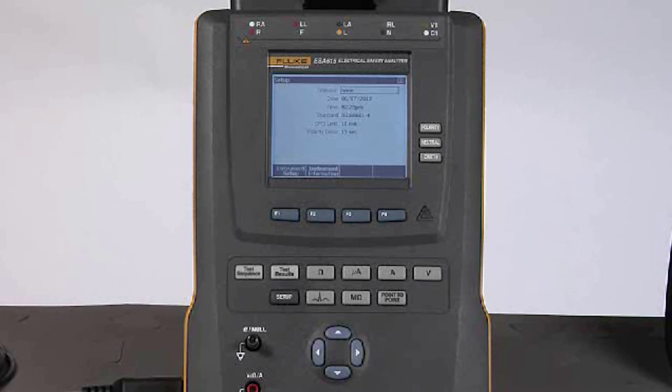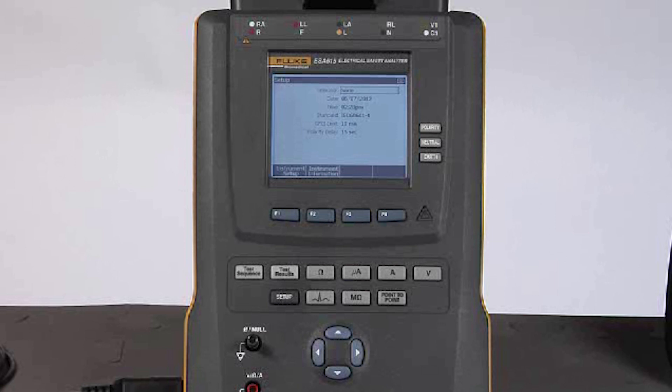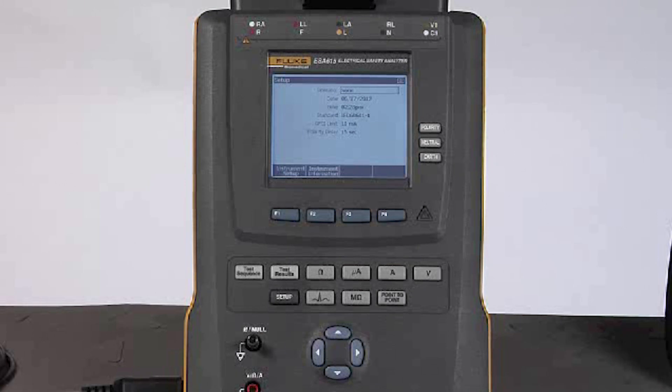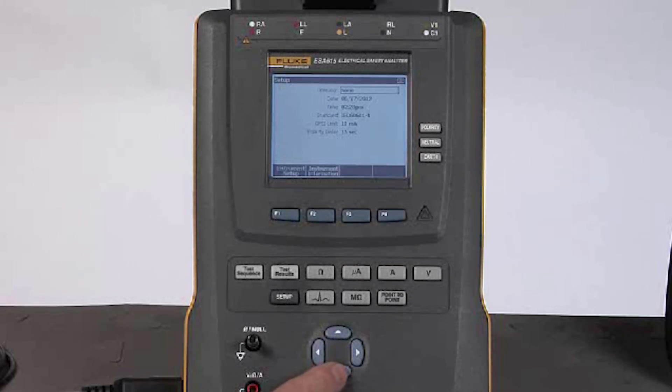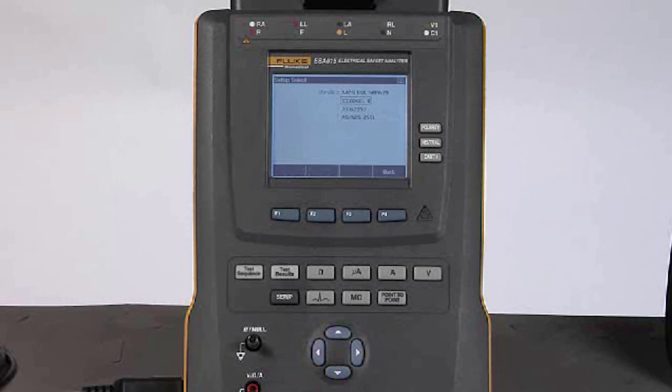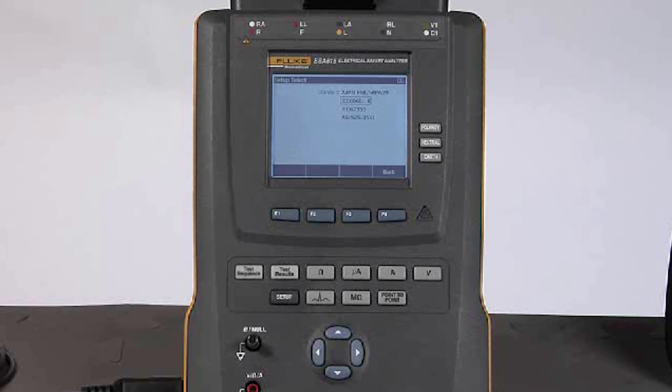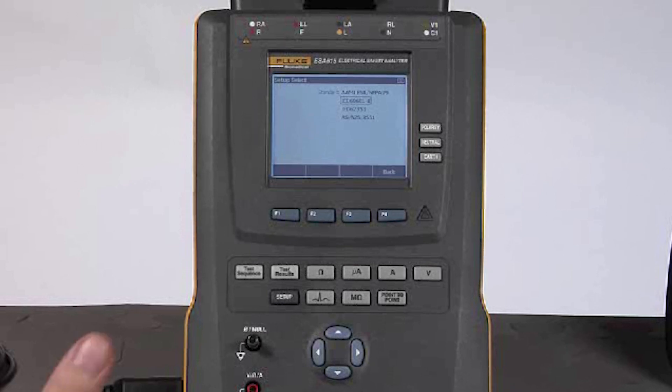The other setting here that is really important to make sure that I select is the standard. To get there, I just arrow down to the standard and press enter, and I can select from a list of US and international standards that will form the foundation of the tests that I'm going to do.